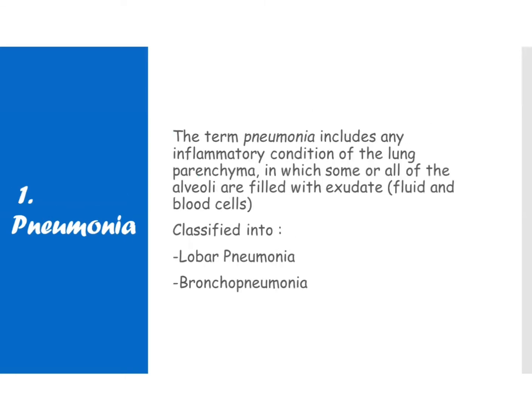So the first condition we'll start with is pneumonia. So what is pneumonia?